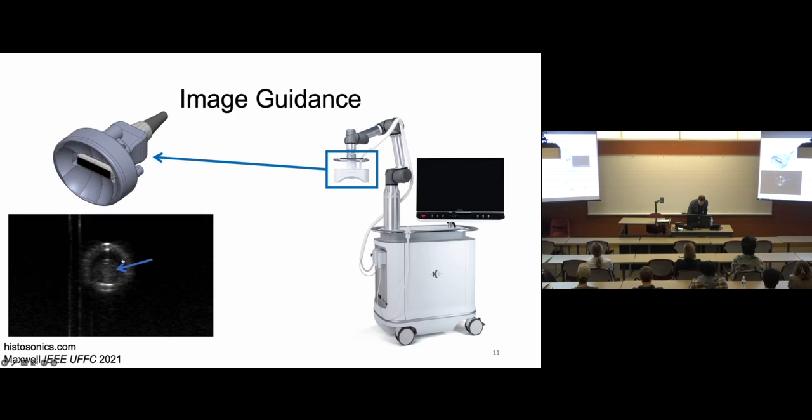This is a clot that we are treating. You can see this vessel. The clot is right here. As I play this image, you'll see this intermittent flickering that's occurring, and that's the confirmation that you're generating bubbles within the clot. Now, if I pause this and I were to ask you to point out where the bubbles are, I don't know if anybody can really do that, but you have a better eye than I do.